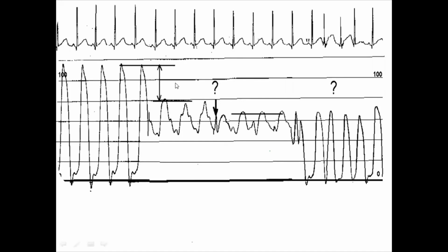There is a systolic gradient between LV and aorta, indicating severe aortic stenosis. Yes. Here, if we have peak to peak, maybe around 20, maybe around 30, 35, something like this. So it goes with the diagnosis of aortic stenosis. So now we are pulling from LV to aorta.